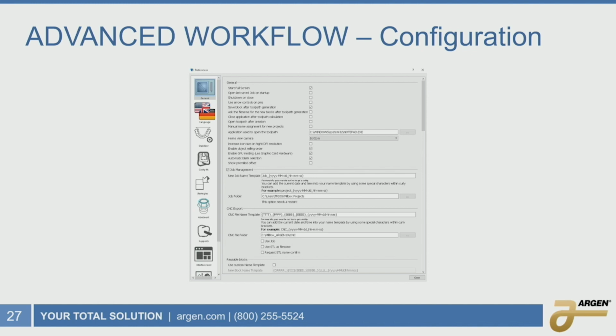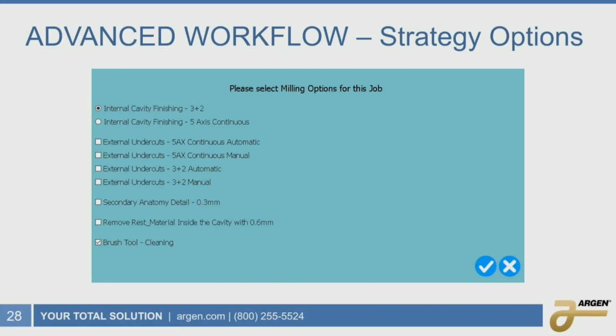So we also have some general settings. This is where your job files are being stored, and where your STL files are coming from. We have options for language and stabilizers. If any of you are doing full arch bridge work and you notice there's a lot of options for stabilizers and you have a specific one that you always use, you can limit it so it's only showing you that option. We've got some cavity fit options, strategy options, and sprue selection options. All these things can be customized to make your workflows just work faster.